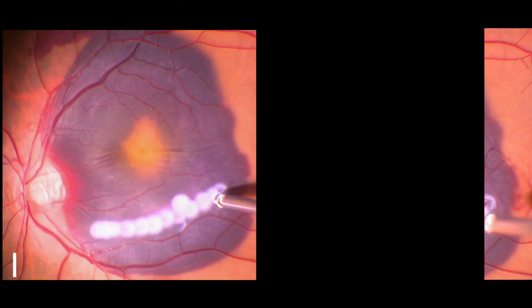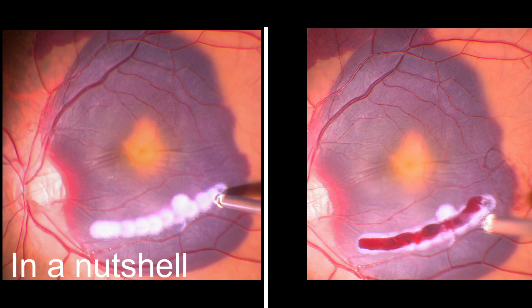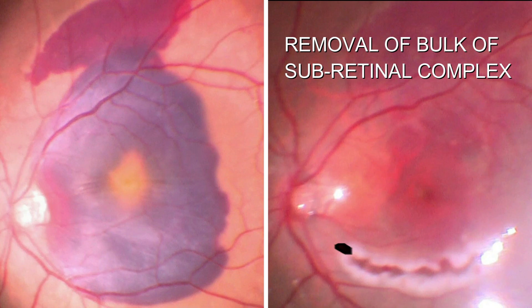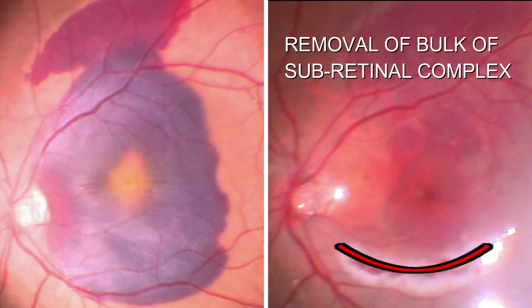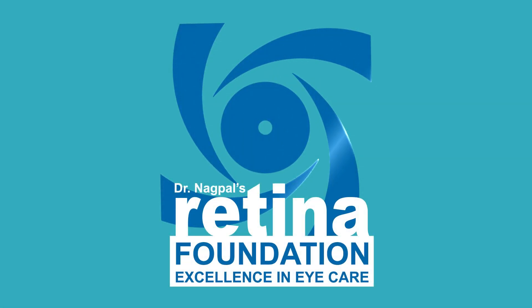In a nutshell, the smiley incision helps in removal of the bulk of the subretinal complex with good rehabilitation.